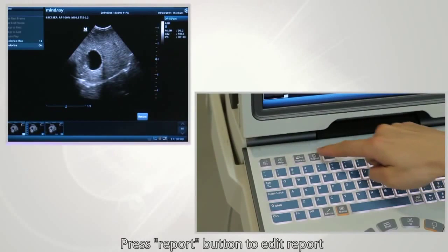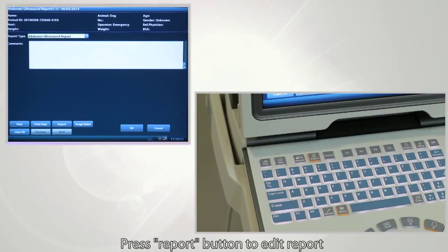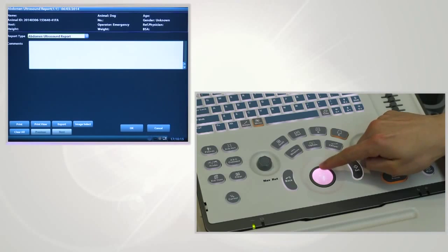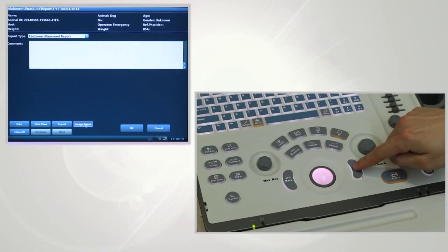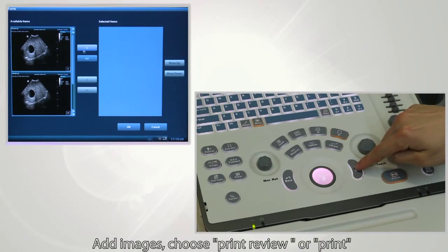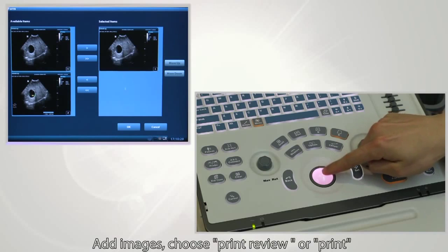Press the report button to edit the report. Add images and then choose print preview or print.